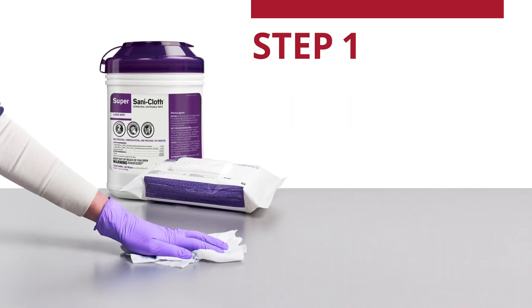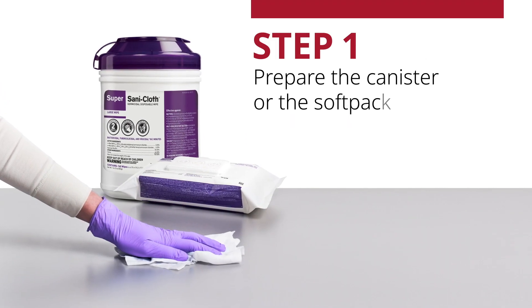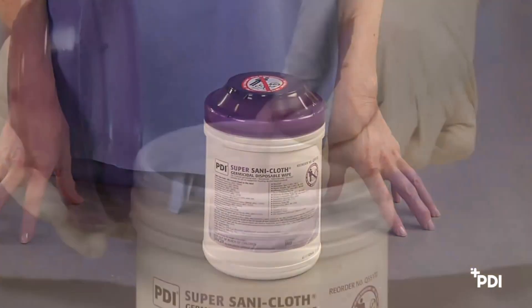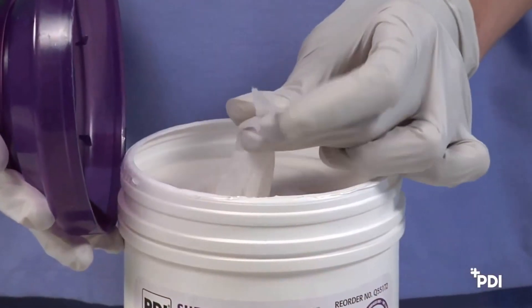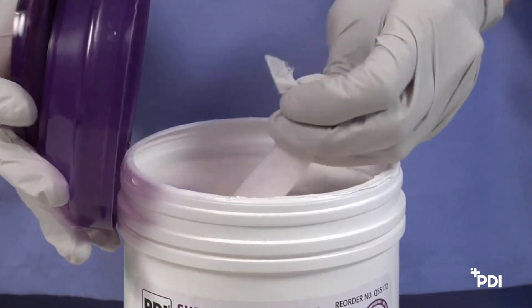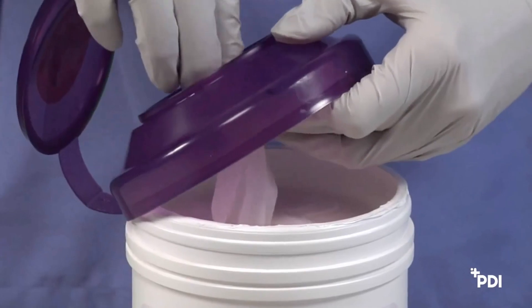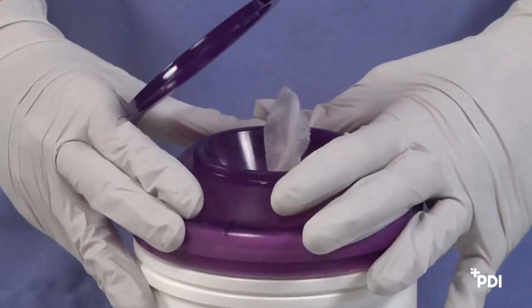Step 1: Prepare the canister or the soft-pack. To prepare the canister to dispense the first wipe, find the center of the wipe, then twist the corner of the wipe into a point and thread through the hole in the canister lid. Next, pull through about 1 inch and replace the lid.